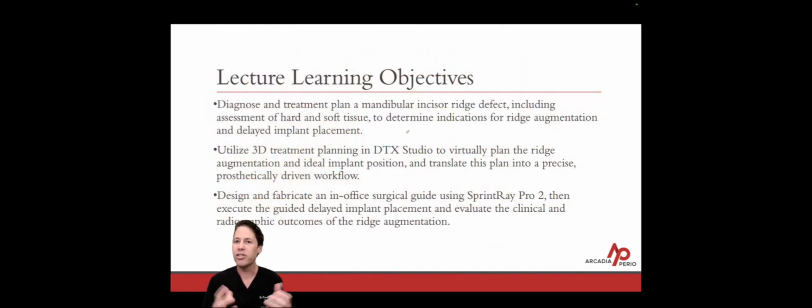So again, just a fun case that was completed at my office, from building up the bone in the anterior mandibular sextant to implant placement, with a digital workflow component with intraoral scanning, CBCTs, and 3D printing, to the surgical execution of the plan with predictable, precise results.